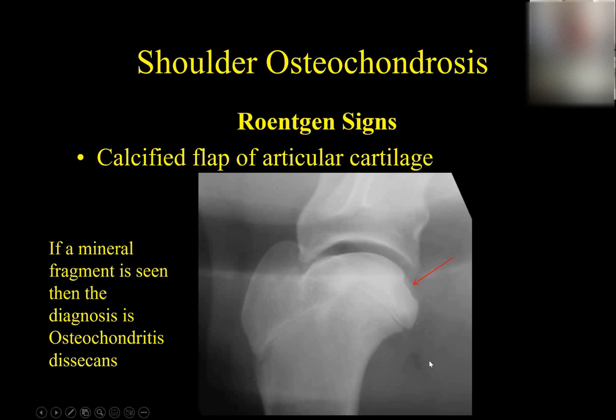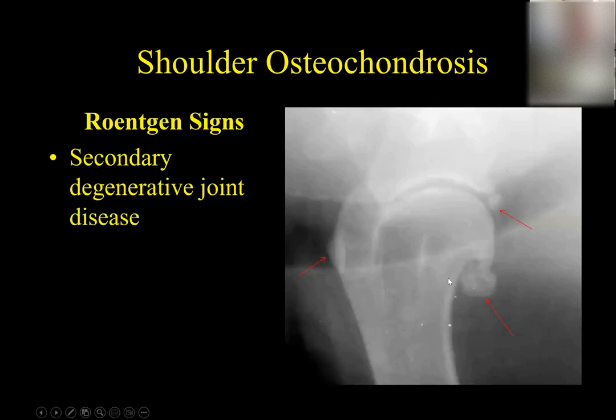So this animal has several mineralized joint mice inside the joint. And I kid you not, also in the literature, if these are really small, they call them joint mice. If they're somewhat big, they call them joint rats. And if they're huge, they call them joint cats. That's very commonly known in the medical literature. So now you've been introduced to that terminology.